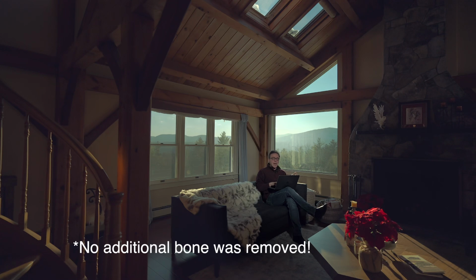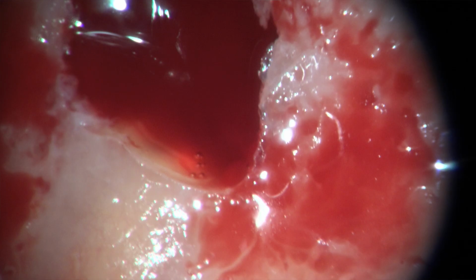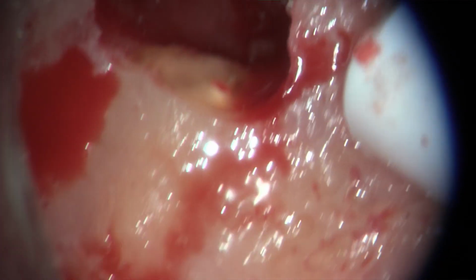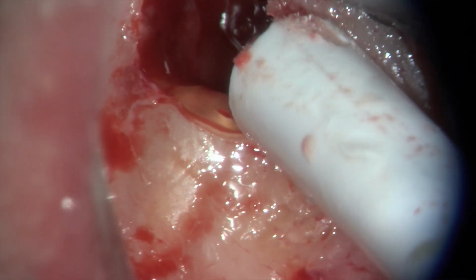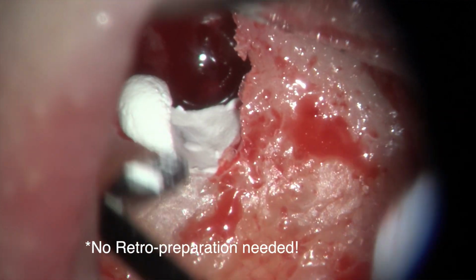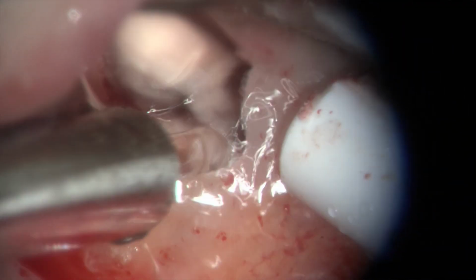And then we take a look at it, because the MB1 and MB2 oftentimes have an isthmus. In these types of cases, we don't necessarily have to place anything. You can see that everything looks nice and clean here at the apex. But since the water from the handpiece can sometimes create a little bit of a divot in the canals, because the putty is not yet fully set, since we're doing the procedure right away, all I do is take a little bit of the putty and smear it at the apical area of the tooth and then brush over it. That can shove the putty into any of these divots, and if there's any isthmus that is open, that could fill that as well.